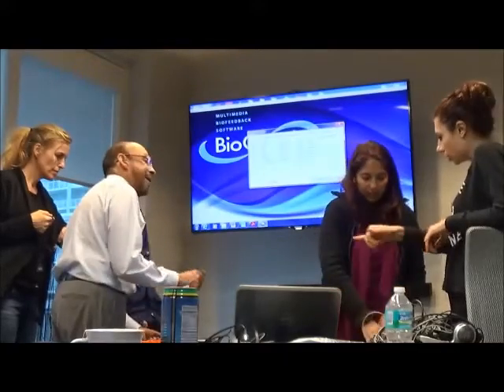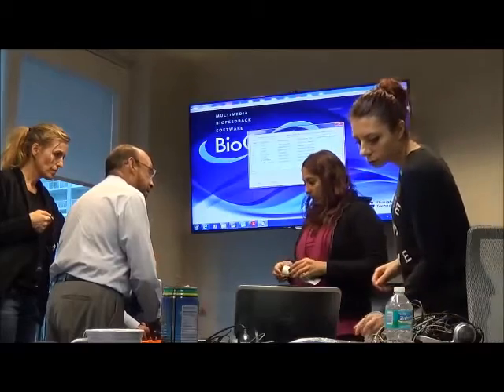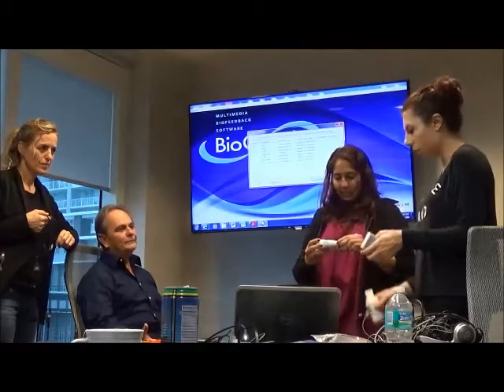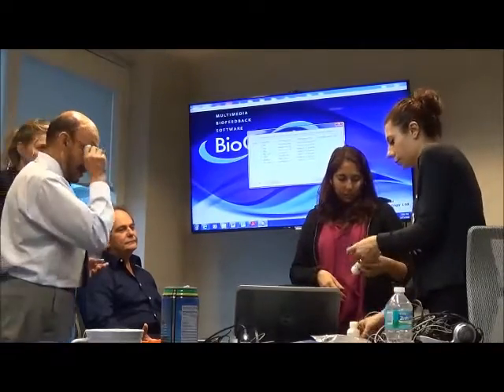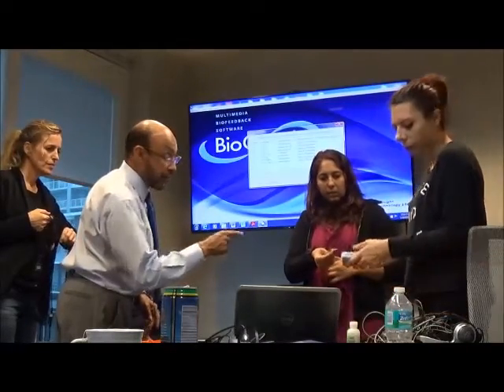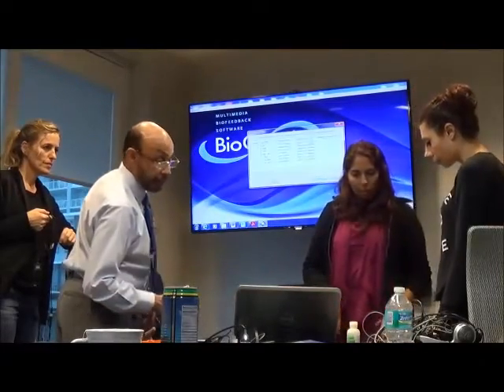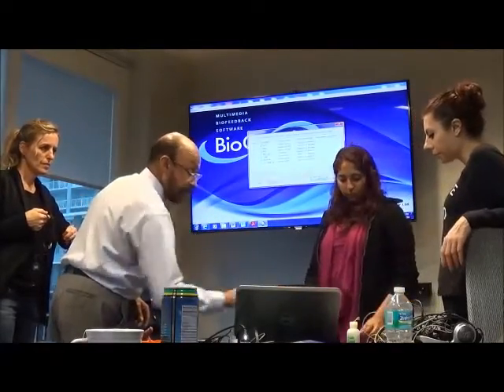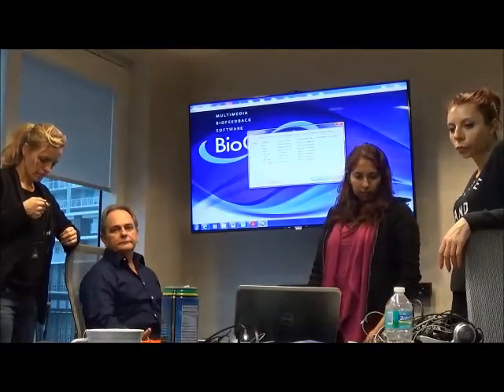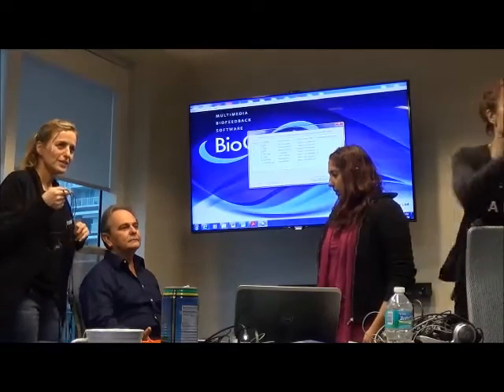Remember, I have to do the hand? Yeah. You have to clean only the part of the finger. You do not need to clean all the hand. Well, the gauze maybe is better. We go for the green one, and this goes directly to the sensor, but a very small amount of gel, very small amount. Here's some gauze. Thank you so much.